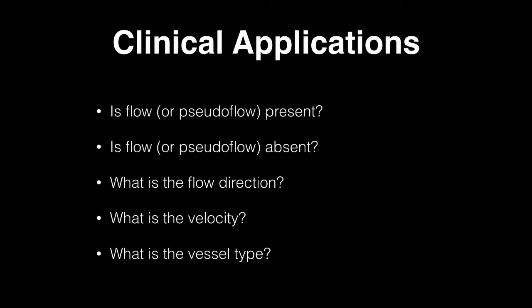Clinically, that means we're going to use Doppler ultrasound to assess, is flow or pseudoflow present or absent? What is the direction of the flow? What is the velocity? And what is the vessel type?